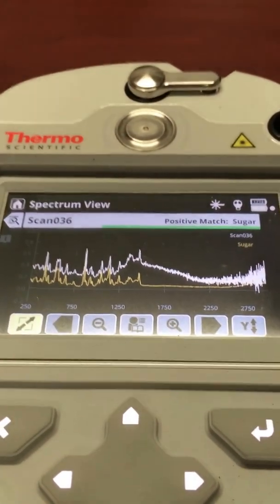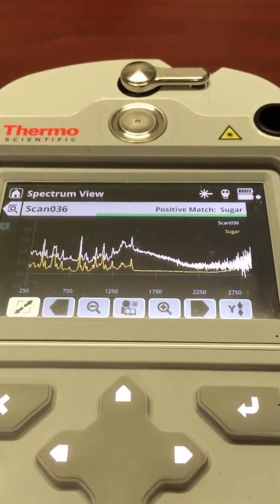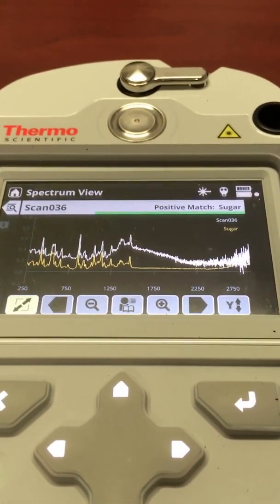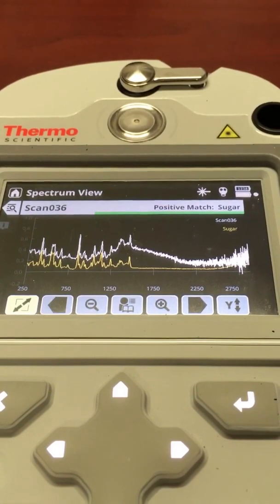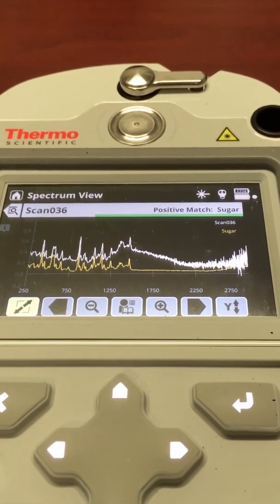You can also look at the waveform to see how the result looks.